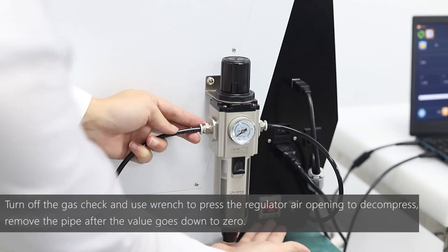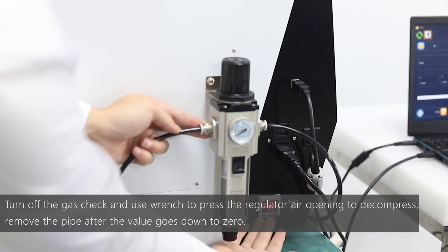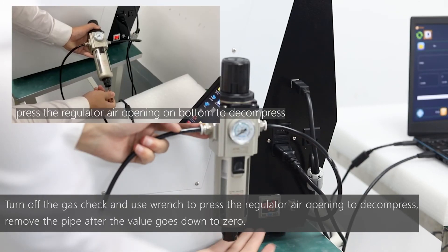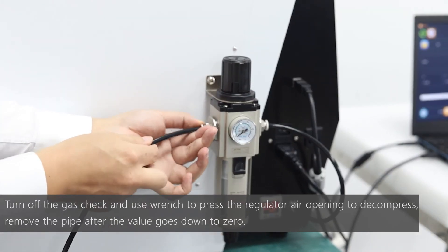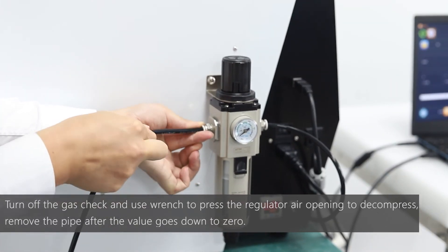If you need to remove the pipe, make sure to shut down the gas check and use the wrench to press the regulator air opening to decompress. Remove the pipe after the value goes down to zero.